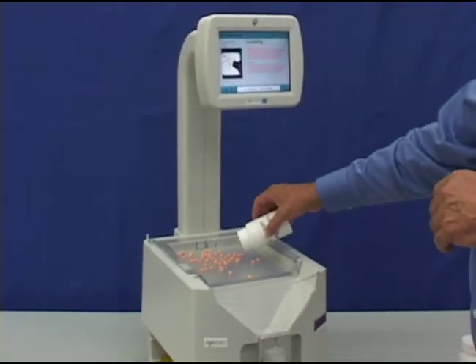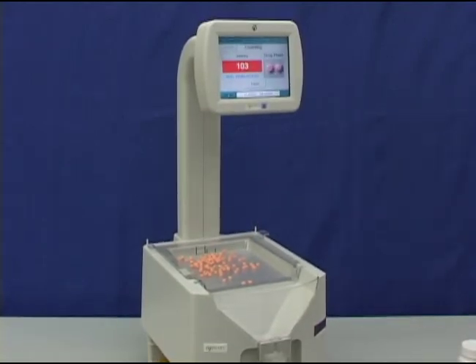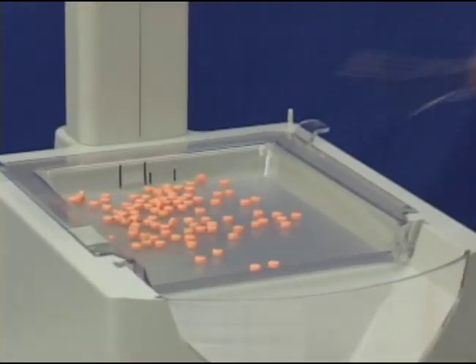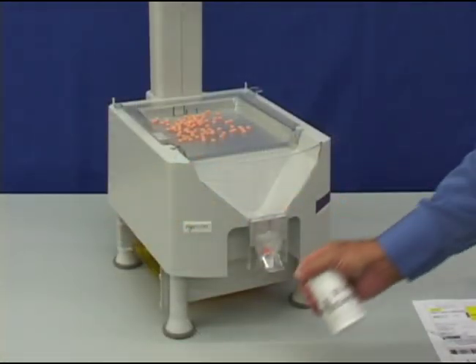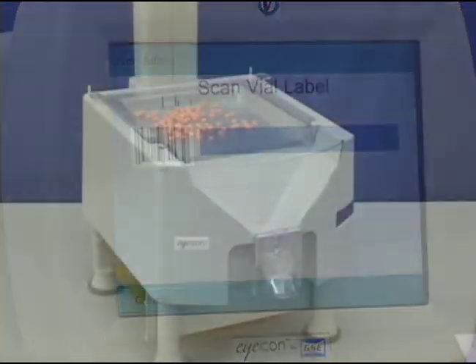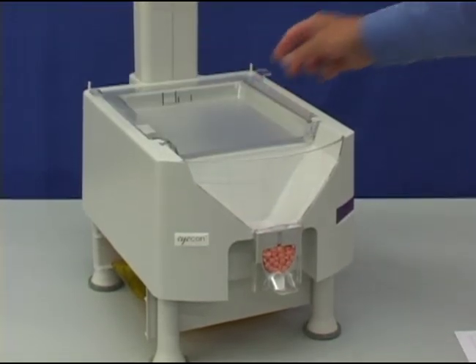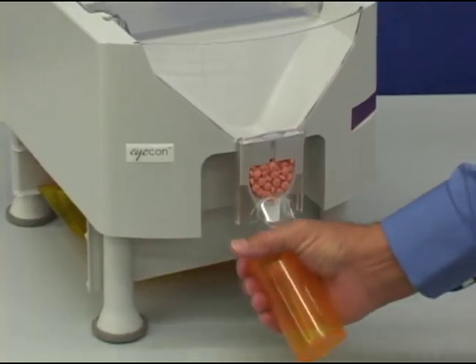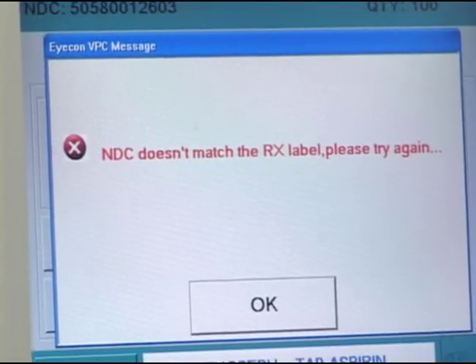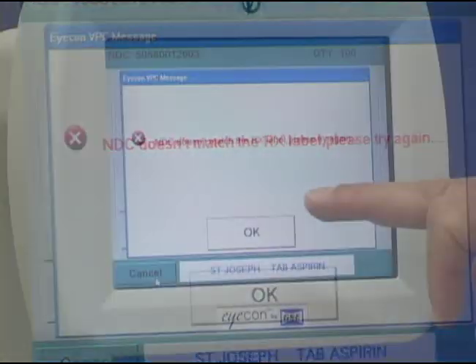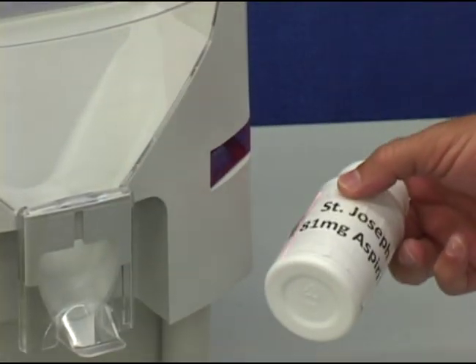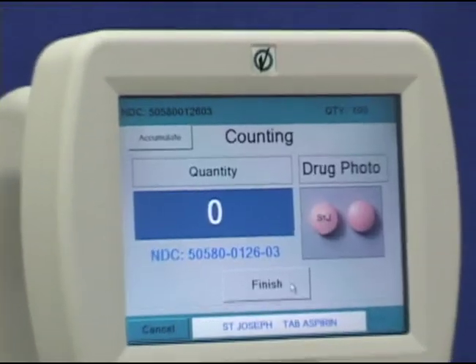If you have too few pills, spread some more from the stock bottle onto the counting platter. If you have too many pills, remove the excess with the supplied spatula into the dispensing funnel. Return the excess to the stock bottle, then press Finish on the screen. Tip the pills into the dispensing funnel and lift the dispensing gate to fill the script vial. In the validation mode, if you scan the wrong stock bottle for a script, the screen will show a warning message. Press the OK button on the screen, scan the correct stock bottle, and continue with the rest of the normal counting process.